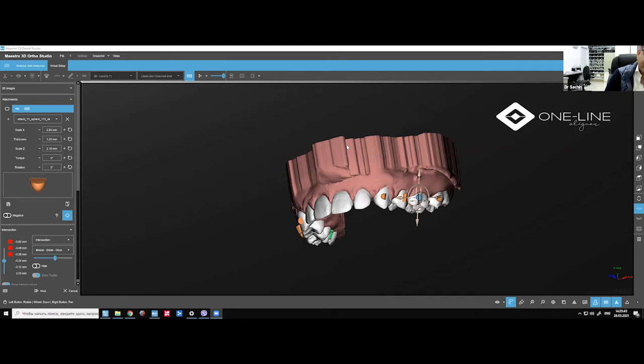So what we did was power ridges with the pliers. We have a set of 16 different pliers for different movements, and negative attachments on the gingival part of the upper teeth, or on the incisal palatal side, to get the movement. But we have also been doing negative attachments on premolars now to get better retention and more push on the anterior teeth.